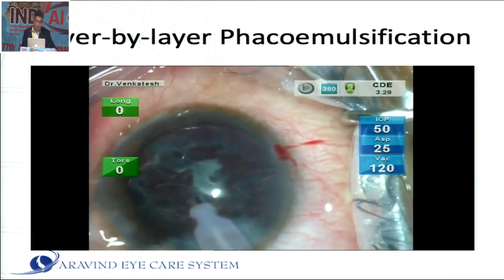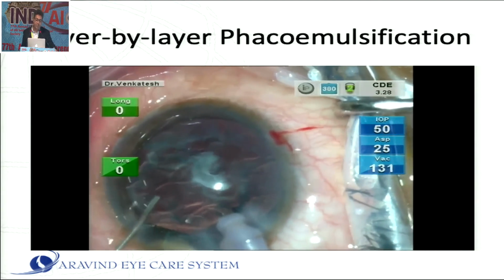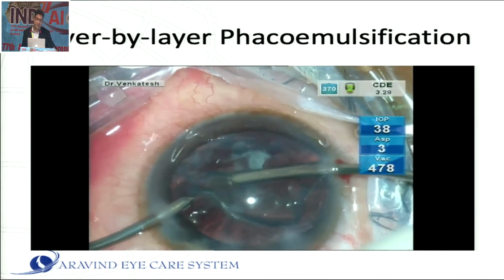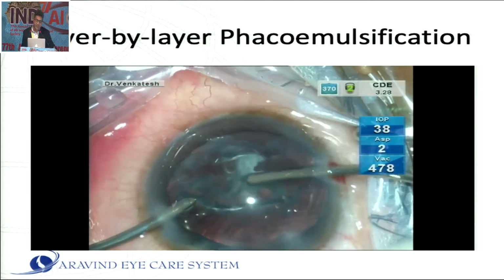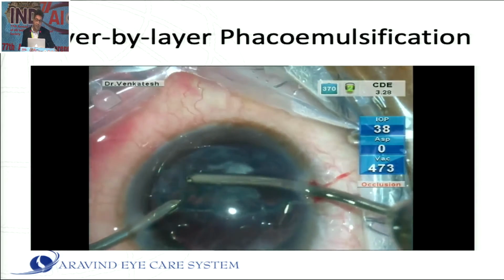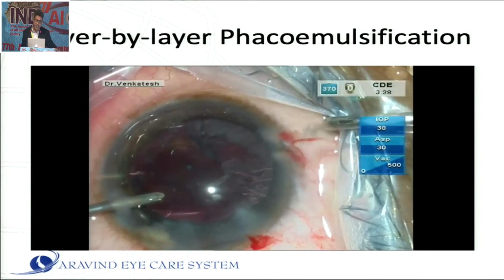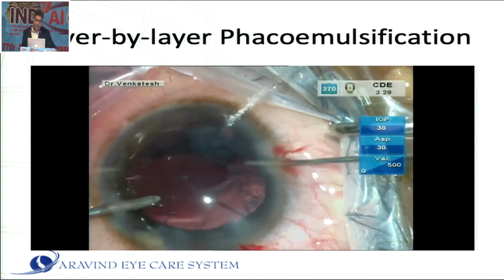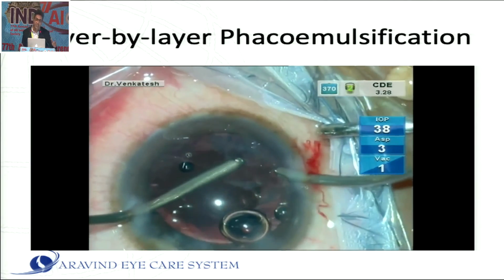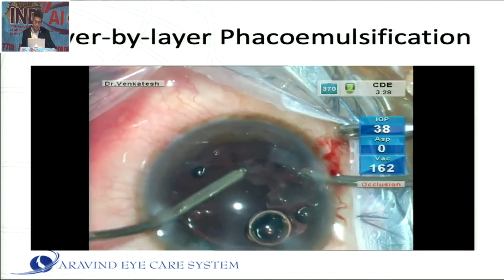So once you remove one part of it, the nucleus, the next part of it will be the epinucleus and the cortex. So anywhere when you're coming out, like the other speakers, again, I would insist that you cannot allow the chamber to collapse here, because this dehiscence will automatically enlarge and you will have vitreous. You need to push in high molecular weight viscoelastic before you do any step. So the hydro has to be in place, and then inject viscoelastic before you remove the hydro cannula.